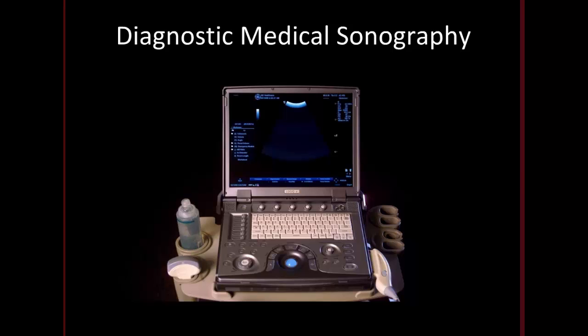The ultrasound waves are going to reflect from tissue interfaces, organs, and regions of different tissue density. And the returning echoes are going to be detected by this here, the probe, and the data generated will be then converted by the computer, the CPU, into a grayscale image for us to interpret on this screen.